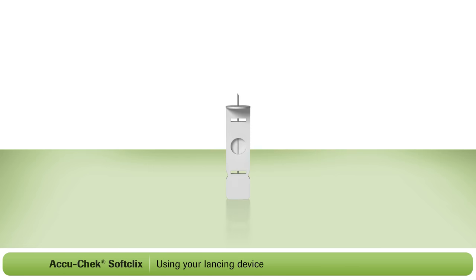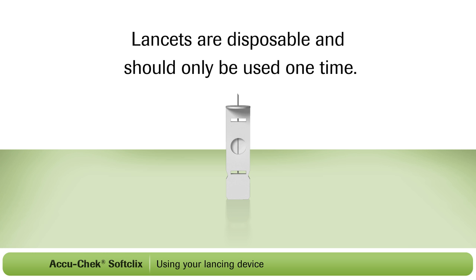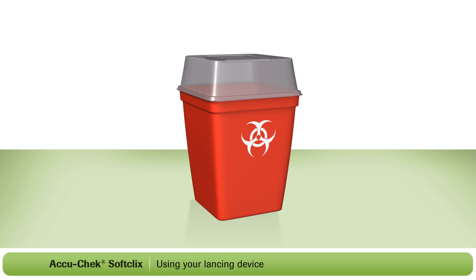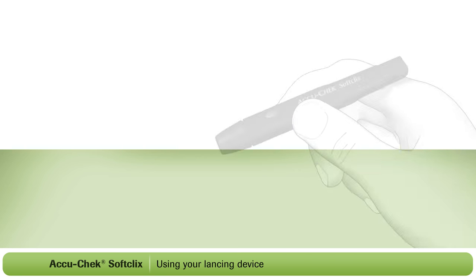This part is important. The AccuCheck SoftClicks lancets are disposable and should only be used one time. A reused lancet is no longer sterile, will lose its sharpness, and become more painful each time you lance your finger. When disposing of a lancet, always make sure that they cannot cause injury and always use a sharps container.